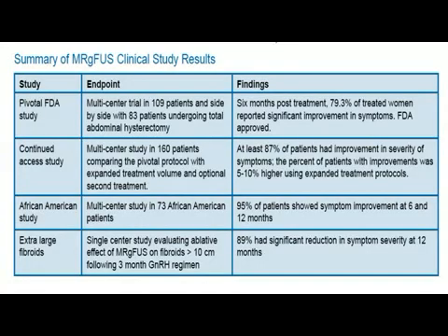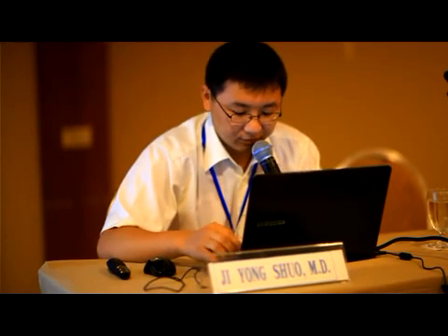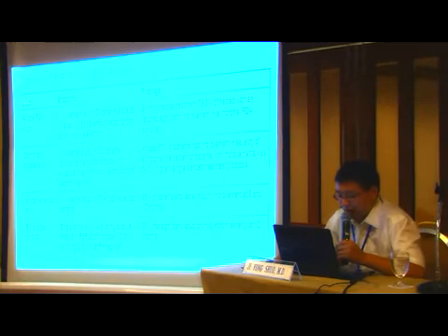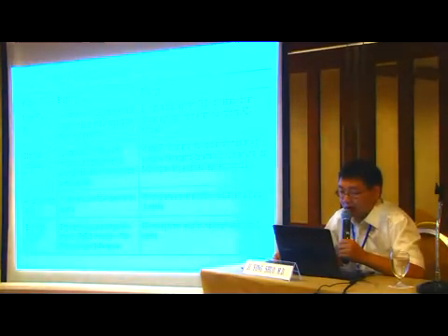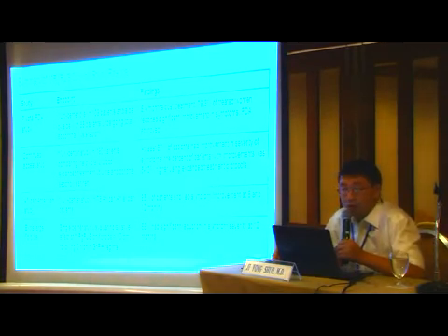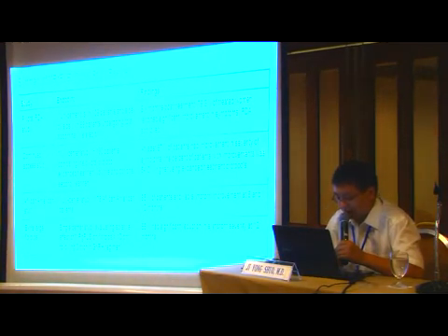Therefore, we can get the initial conclusion about HIFU. HIFU is a new, effective and non-invasive treatment for tumors. The tumor can be inactivated by generating coagulation necrosis with high temperature. According to the practical shape of the tumor, owing to the application of high technique, the local treatment of HIFU and ablation can become easy and non-invasive. What's more, it can be repeated. The main indication of HIFU is solid tumors of the pelvic and abdominal cavity.